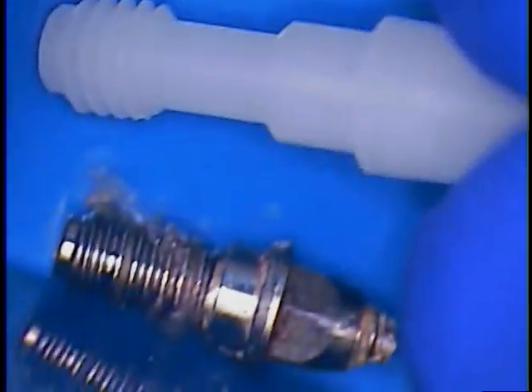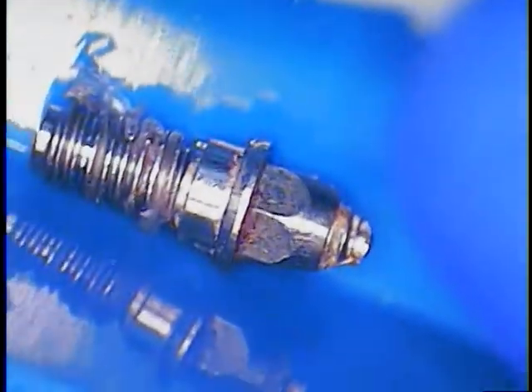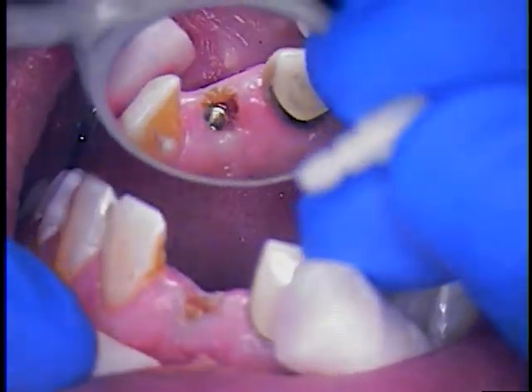Alright. Let's try in our plastic component here. Now, if I were to measure the length of this screw, the fracture that was removed, there it is. That would be too much, too long. So let's look at the other size. Looks like that's our baby right there. Okay, so let's just try this in. We don't need a sleeve on it. Looks like there's one already. Let's see if this goes in. It's all about hand tightening now. Okay, this is an impression coping.